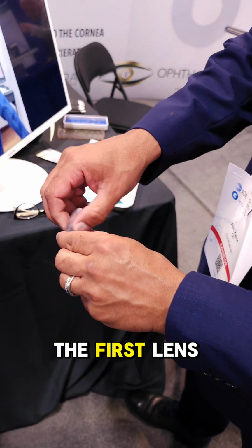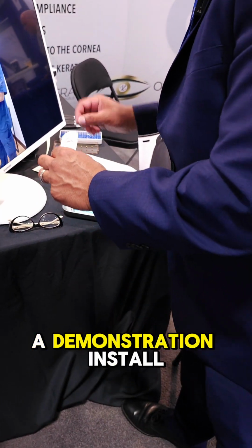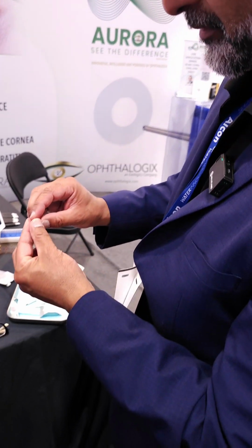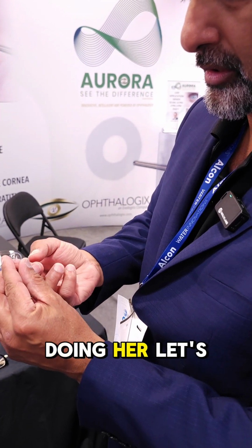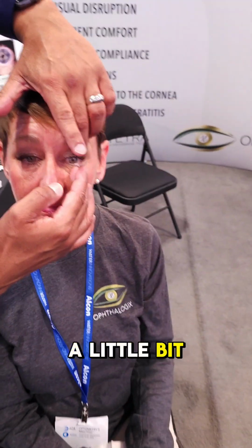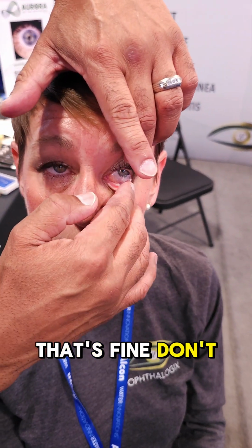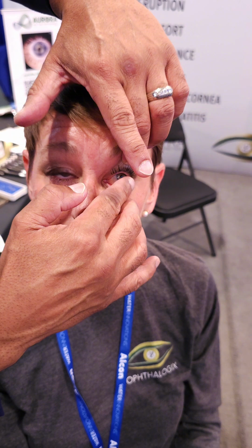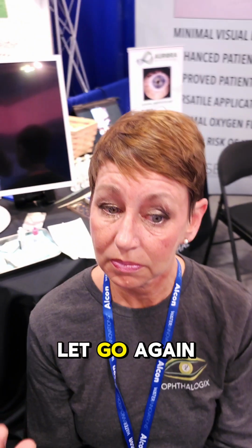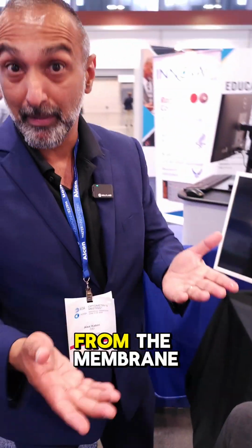I'm going to put the first lens on the eye again because this is a demonstration. So if we're doing her, let's say, left eye, she's going to just look straight ahead. Good. A little bit up if you can. That's fine. Don't blink, don't blink, don't blink. Good. Slow and easy, look straight. I'm going to let the lower lid go, let the upper lid go. Again, for demonstration, now she's protected from the membrane itself, right?